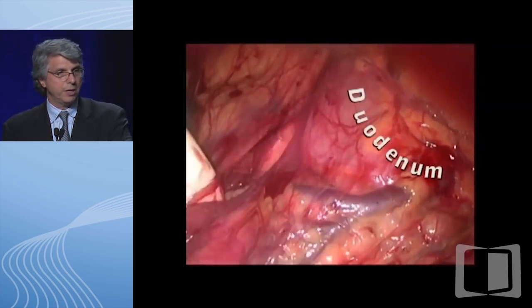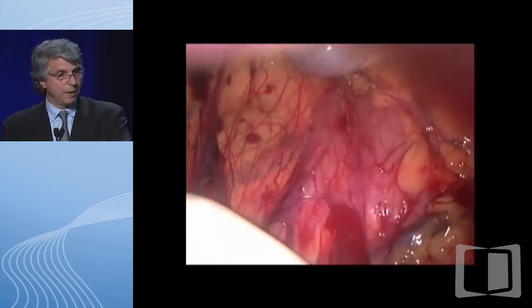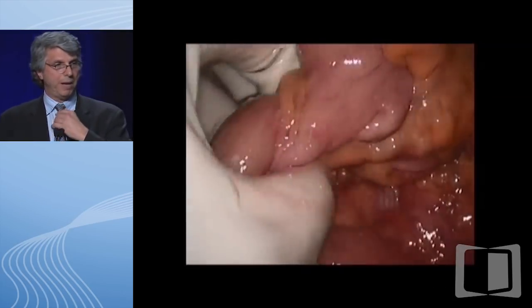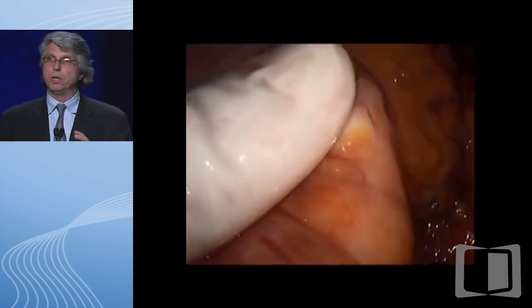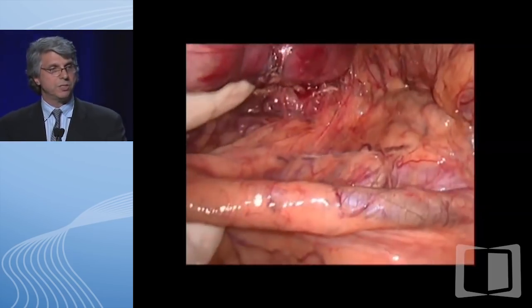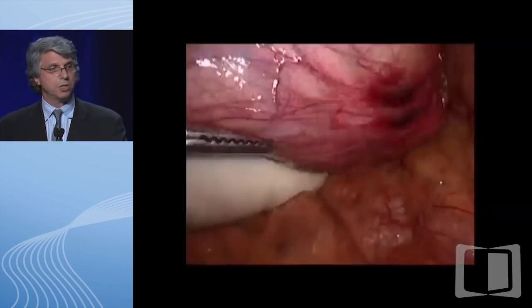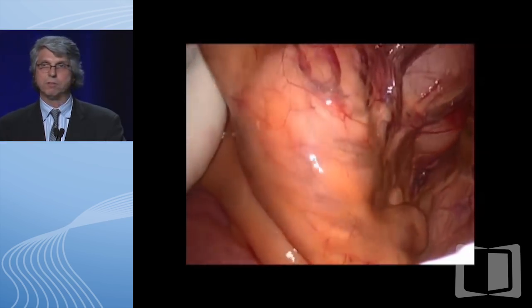The duodenum is in the distance right underneath there. After we mobilize the colon to the mid-transverse colon, we pay attention to the vessels. This is a very important part of the procedure—we try to preserve the ileocolic artery. The ileocolic artery is a vital vessel to keep, and I'll show you why later for pouch length. Sometimes that vessel is very thick, either because of the disease itself or because of mesenteric thickening induced by steroids, which makes our job more difficult and can necessitate a three-stage procedure.